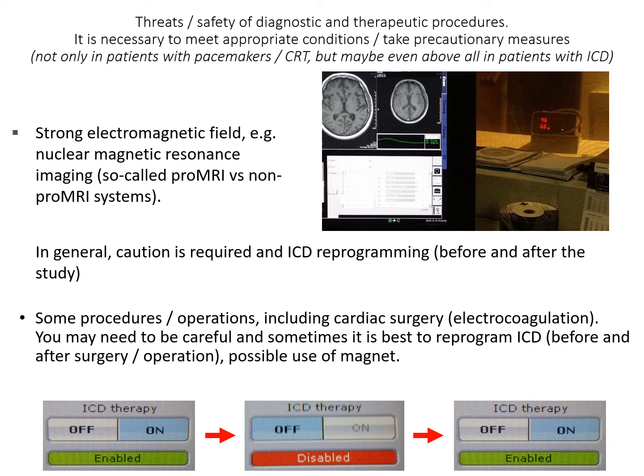It should be remembered that a strong electromagnetic field affects the operation of cardiovascular implantable electronic devices. Prior to magnetic resonance imaging studies, it is crucial to refer the patient for implanted device reprogramming. Such proceedings may also be justified before some surgical procedures.